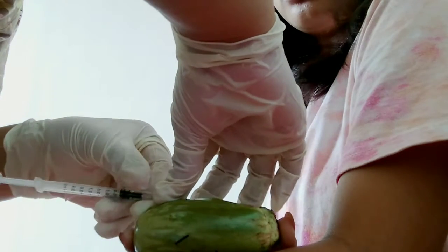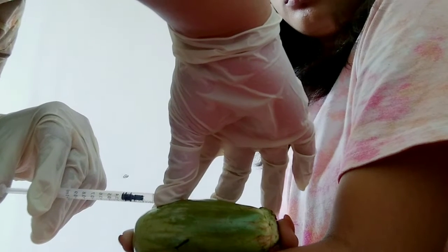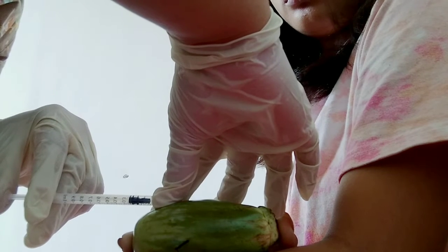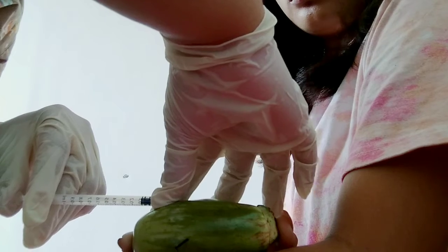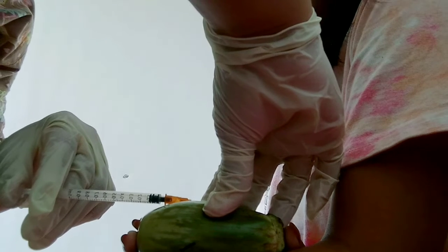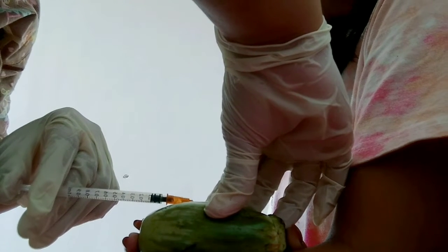And inject the medication gently, until you see a bleb resembling a mosquito bite's appearance.